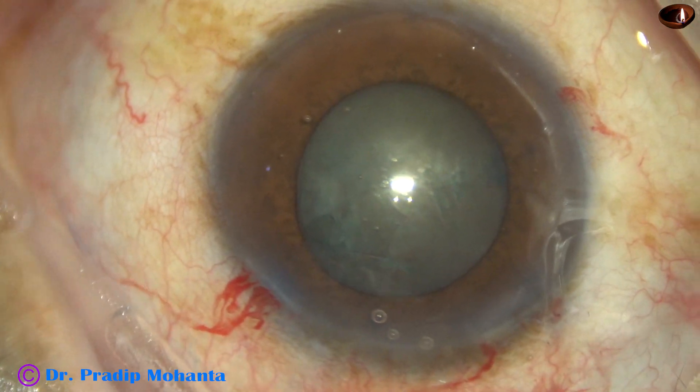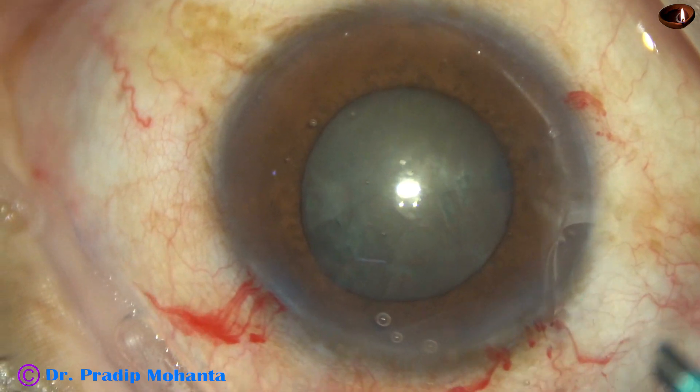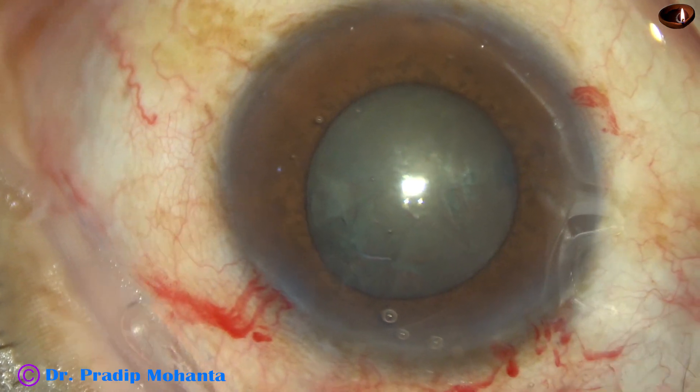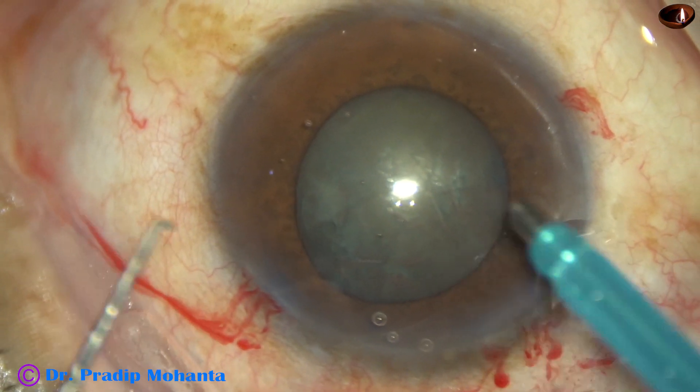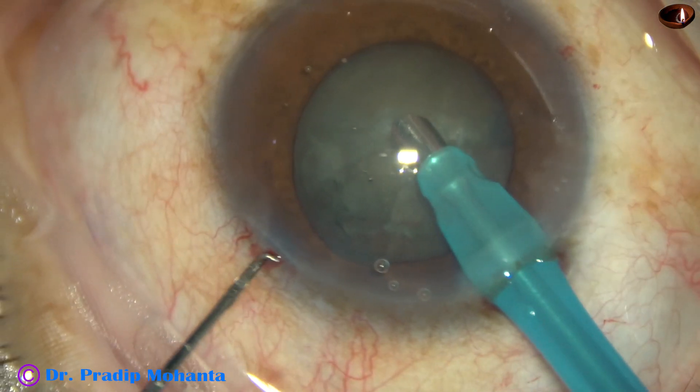My plan is to chop this nucleus into many fragments — about six fragments — and then emulsify the fragments single-handedly, because see what happens.